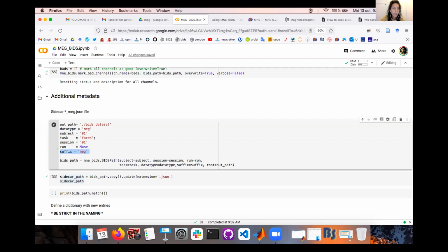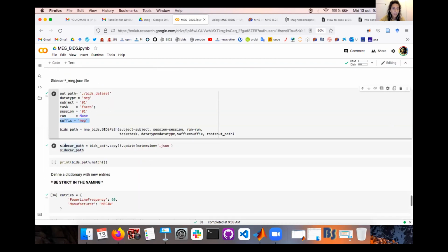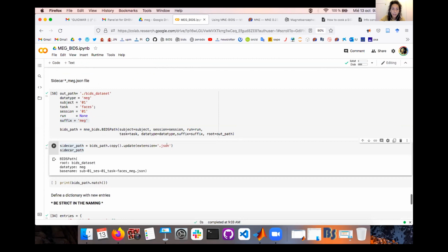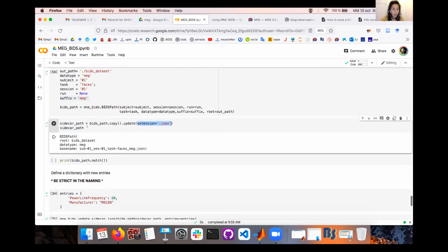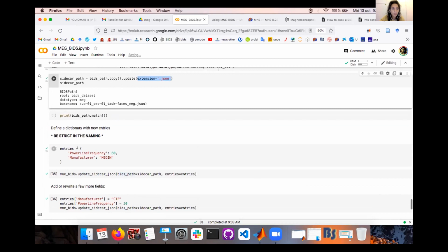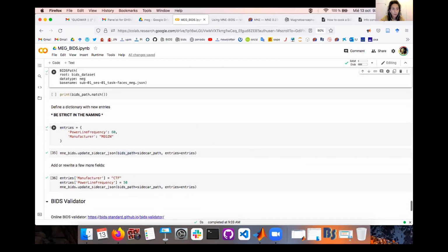Now it's important to add that if we want, for example, the MEG JSON file, we need to specify the suffix, which is MEG, and then we get a BIDS path that we can make a copy of and specify that we want just the extension JSON. So our new sidecar path will be this one to be edited.